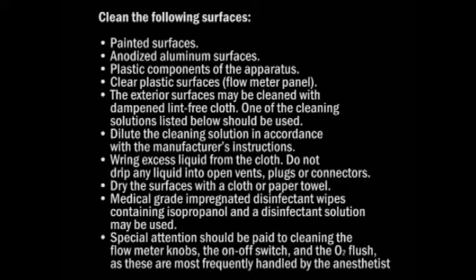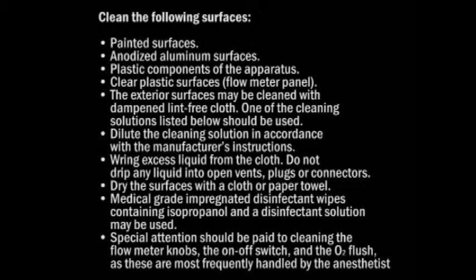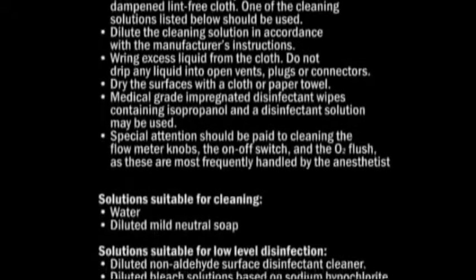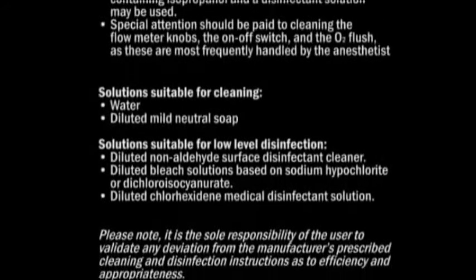Medical-grade impregnated disinfectant wipes containing isopropanol and a disinfectant solution may be used. Special attention should be paid to cleaning the flow meter knobs, the on-off switch, and the oxygen flush, as these are most frequently handled by the anesthetist. Solutions suitable for cleaning: water, diluted mild neutral soap.